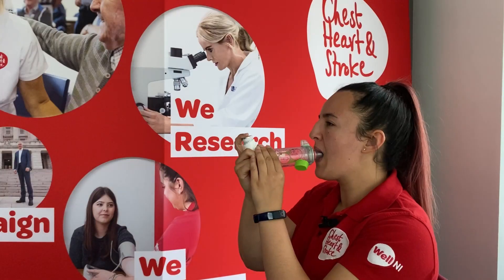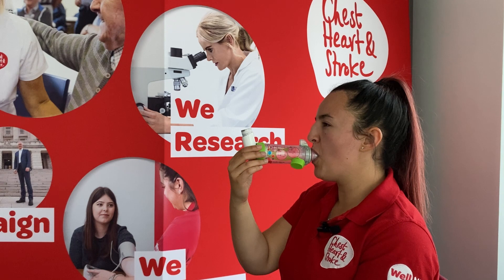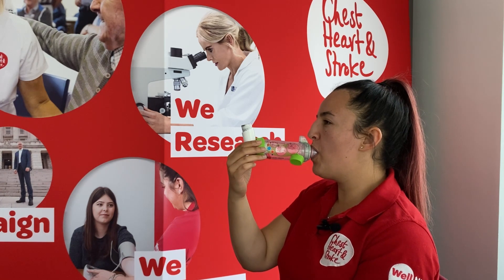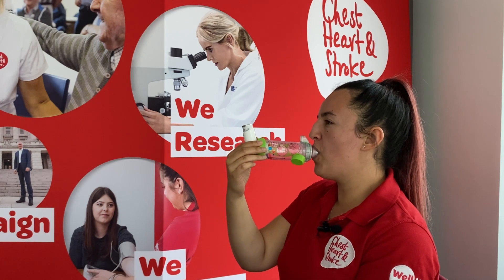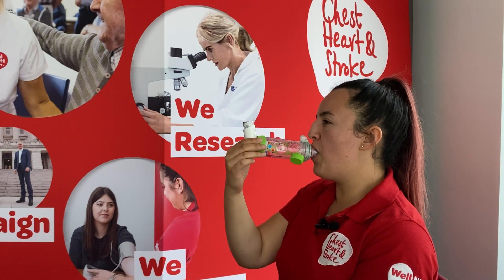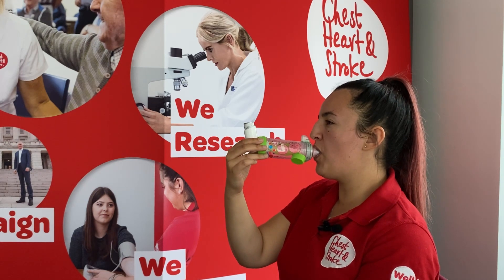So you do it like so. If you require a second dose, wait 30 to 60 seconds.